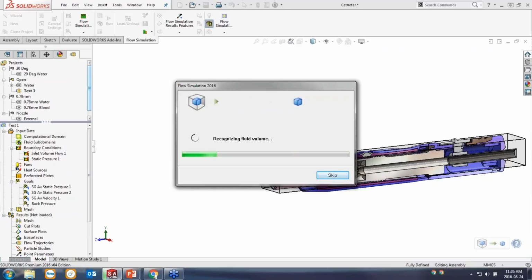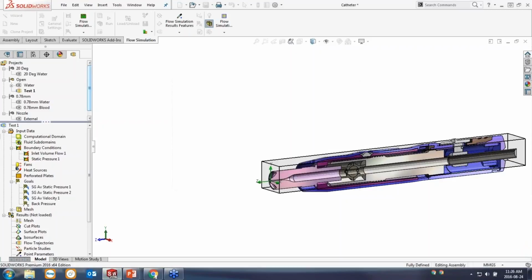Now it's just re-recognizing my fluid volume here based on the boundary conditions that I applied. I told it to exclude the internal regions that did not have a boundary condition. You can see in my model there's some of these extra cavities inside the device. We don't want any fluid running through there, just inside the tube. So it's recognizing that for me.